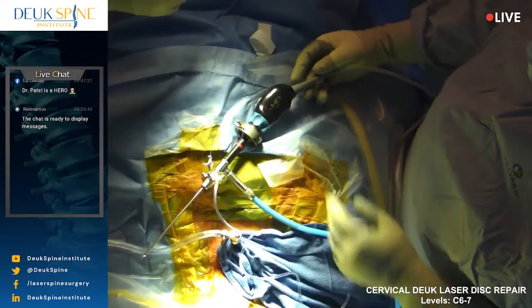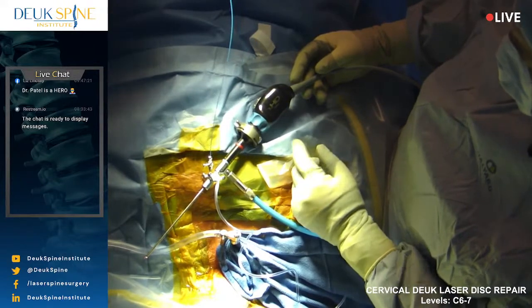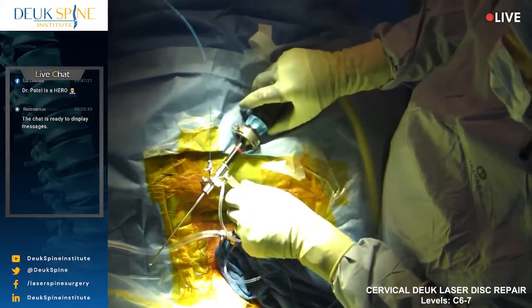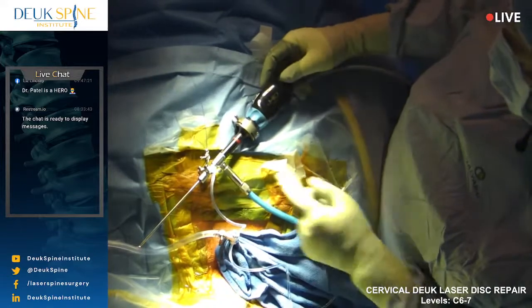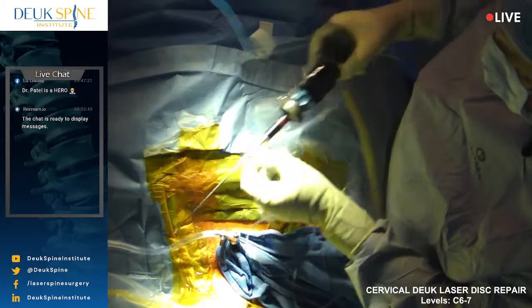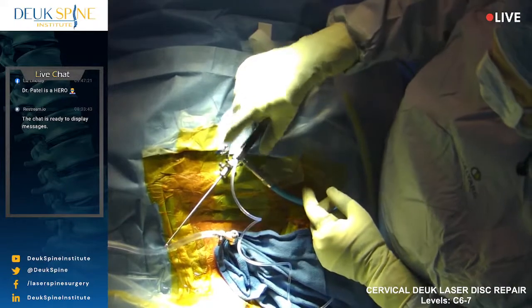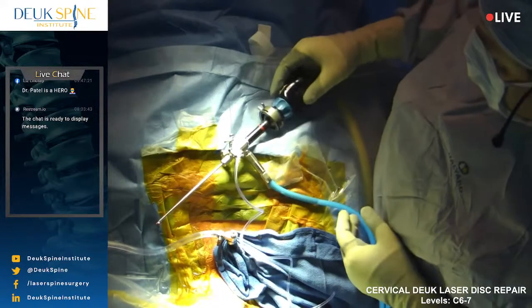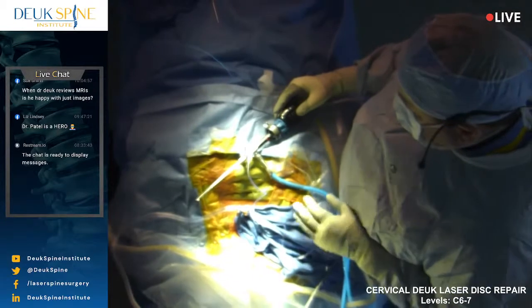So the rig has several parts. It has a camera that looks right here at the back of the lens system. We have a fiber optic scope here. We have a light source here that produces light. We have irrigation that sends water down to the end, so we have constant cold irrigation. We have a laser fiber here that goes in through this, we call this a port. So this scope has 3 ports, 1, 2, 3. And this is the scope that I've been using for 15 years to do all my cervical spine surgery.